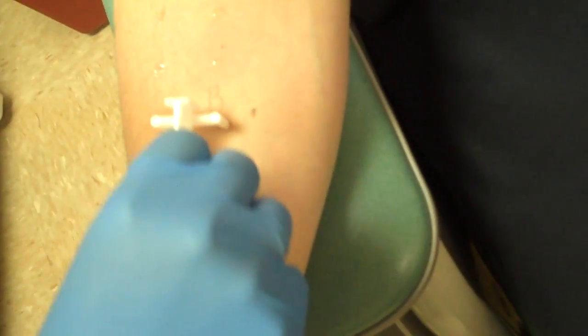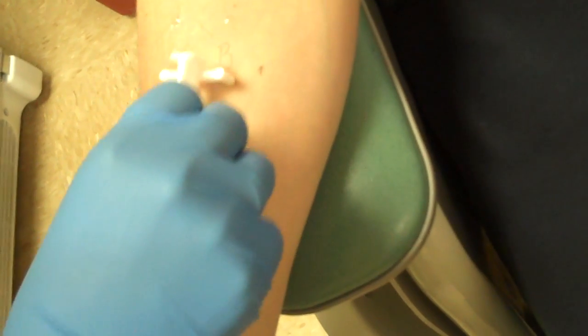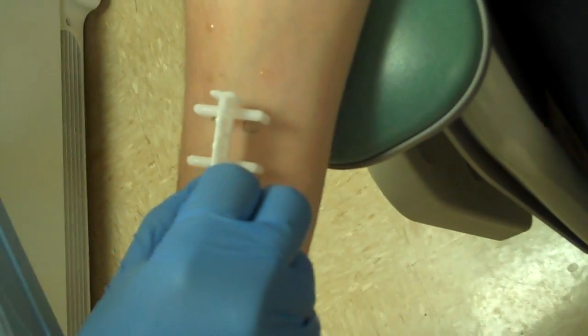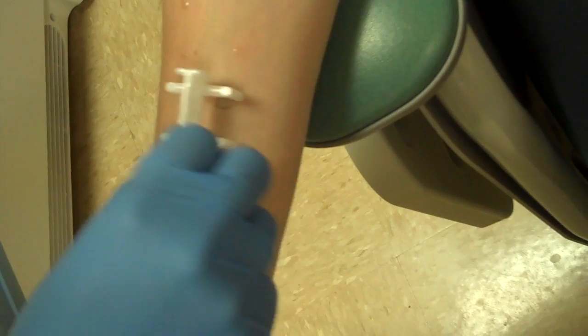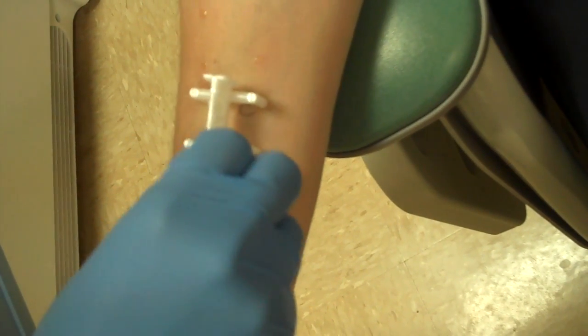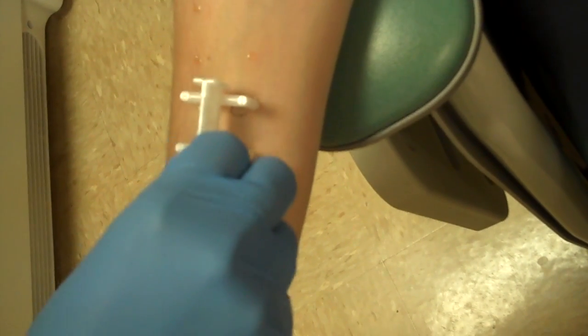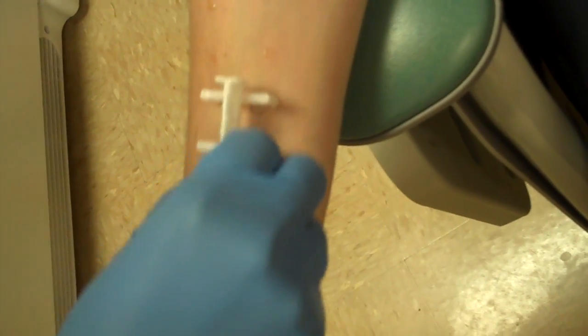Panel number two, or B — same procedure, north, south, east, and west, just applying pressure. And this is not a painful procedure. I do feel her applying the pressure, but you don't even see me flinch because it's not painful. You do feel small portions of the sharper ends of the probes, but nothing painful.